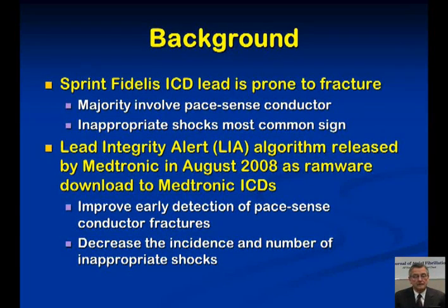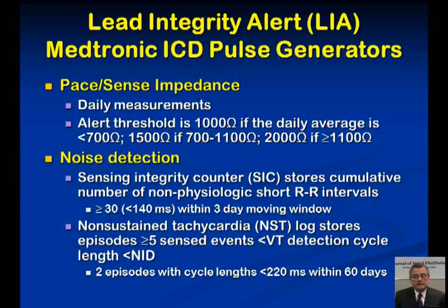a RAMware download to Medtronic ICDs. The purpose of this new algorithm was to improve early detection of pace sense conductor fractures and to decrease the incidence and number of inappropriate shocks. The lead integrity alert algorithm is available only in Medtronic pulse generators. It evaluates the impedance of the pace sense conductor. It performs daily measurements, and the alert thresholds are set according to the patient's individual impedance trend.